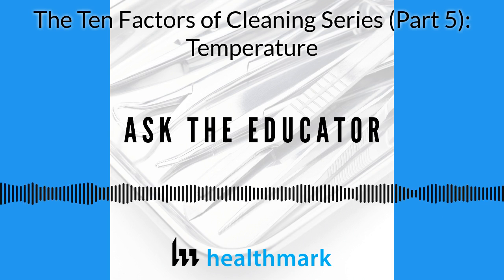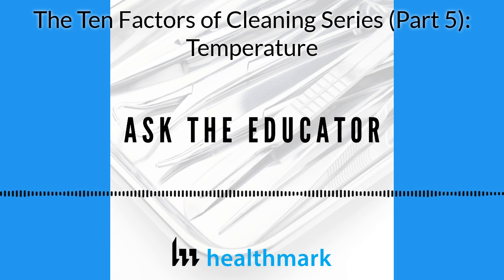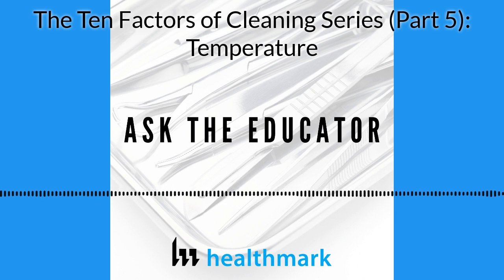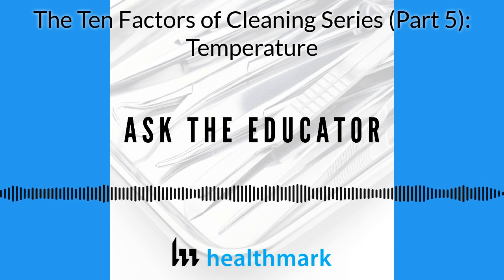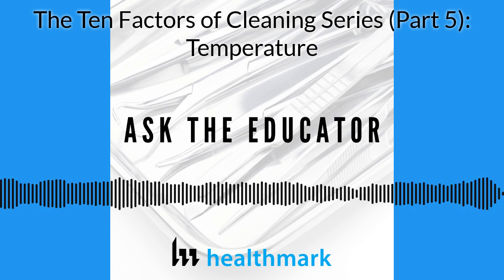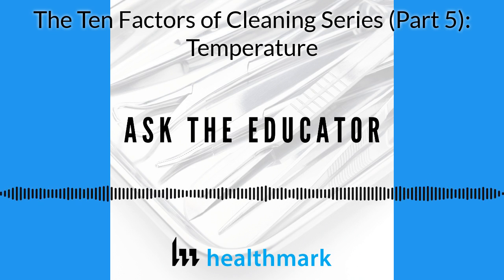And you have to remember that denaturing action of heat on blood, which is the number one soil we're trying to get rid of, becomes more insoluble and it's harder to clean as it gets more insoluble. So that's why you start with a cold rinse. So you need to use the recommended temperatures for your cleaning solutions and monitor them. And does that sort of make sense as we're starting to build up on temperature, Kevin?